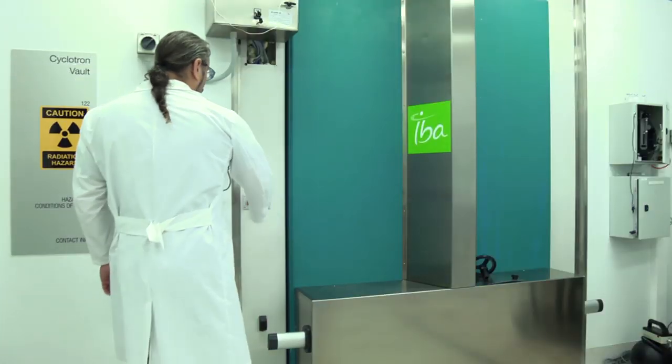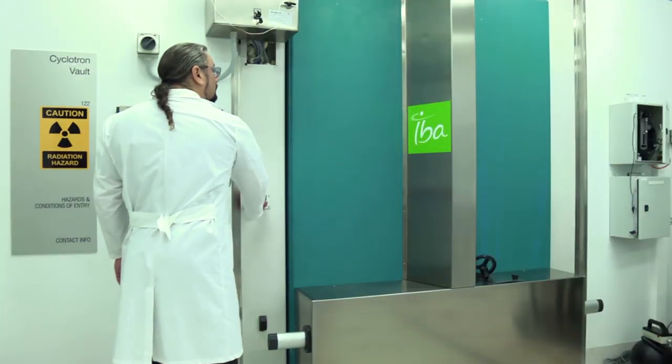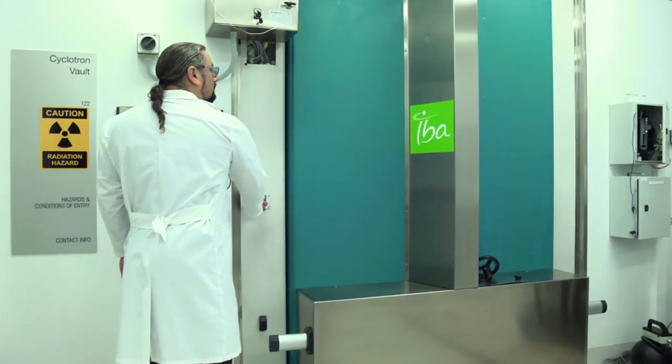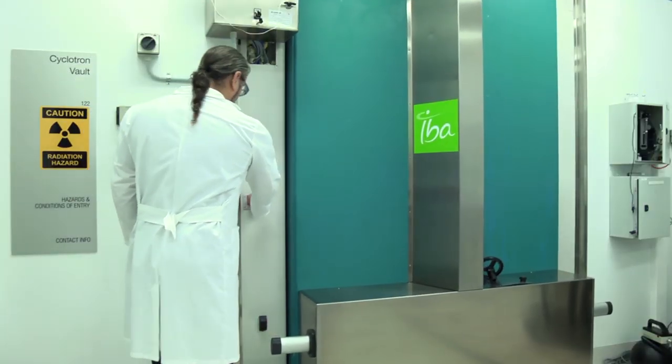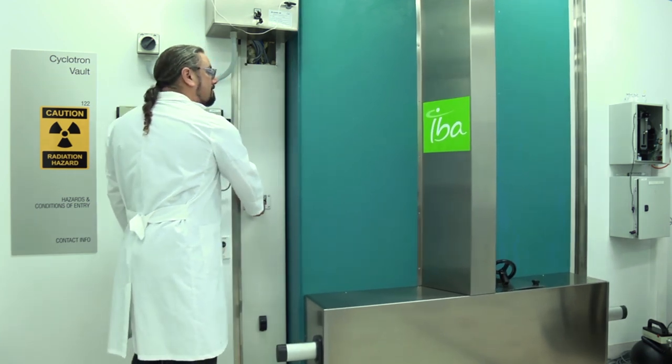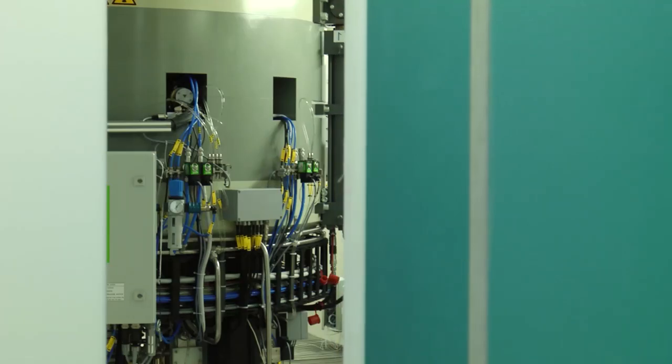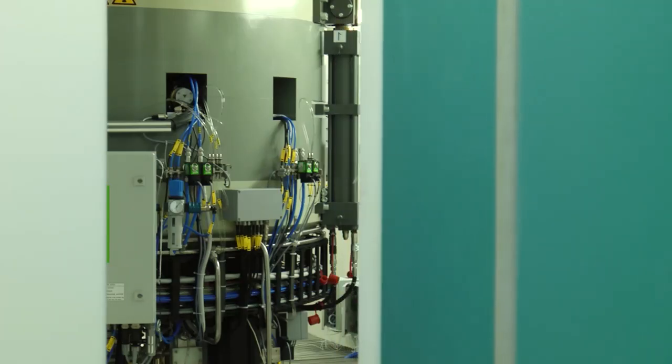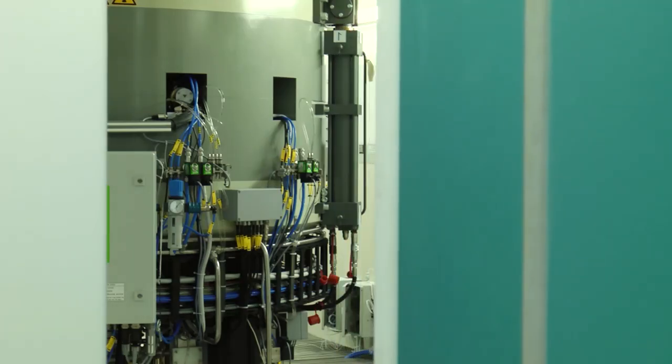Cyclotrons usually are within a bunker or vault used for radiation shielding to protect people outside when the machine is operating. The walls are made of concrete approximately 2 metres thick.